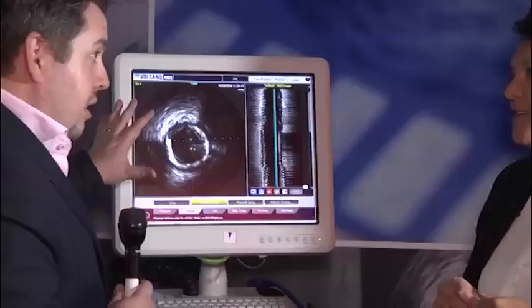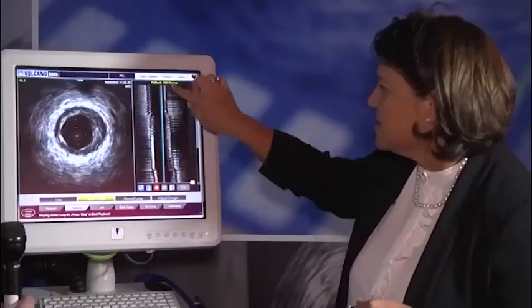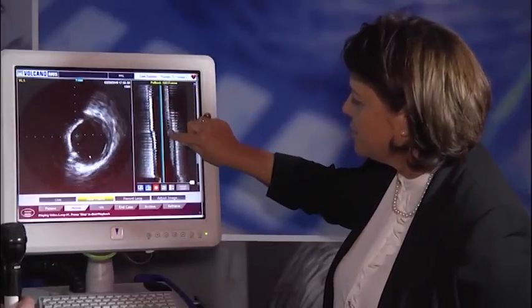Absolutely. For the untrained eye, it looks like a lot of turning spirals, but for the trained eye, like yourself, there's quite a bit of information coming up here. When you look at this, you see the 360 degree view, and that area there is where you go through the tube, so you're inside the artery. This we call the longitudinal view, because as you pull the catheter back in the heart, it gives you a view of what's going on inside the artery.